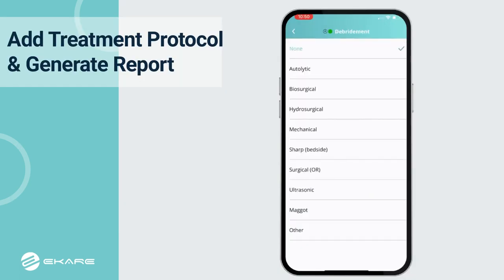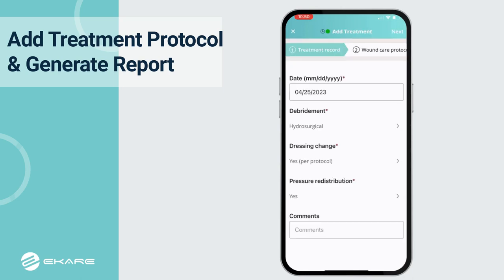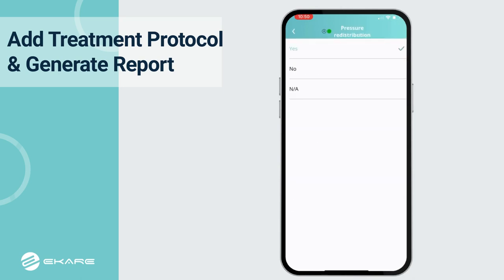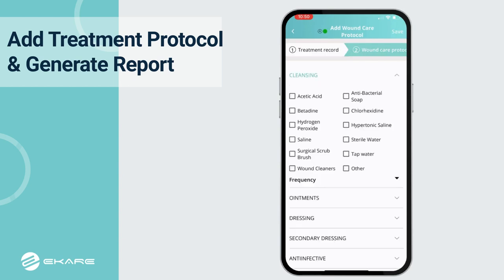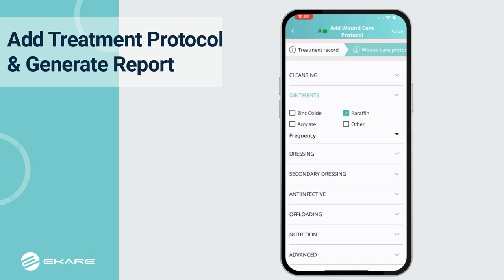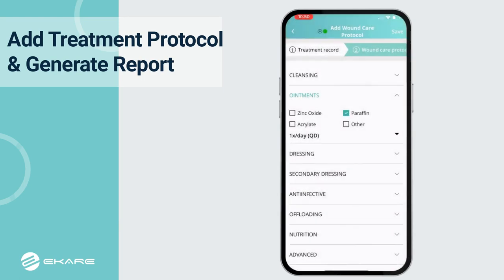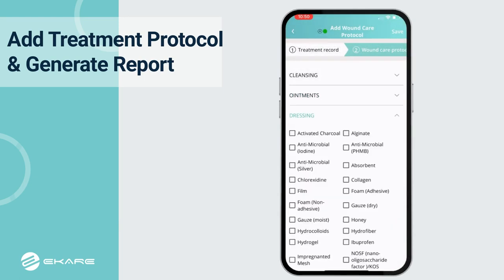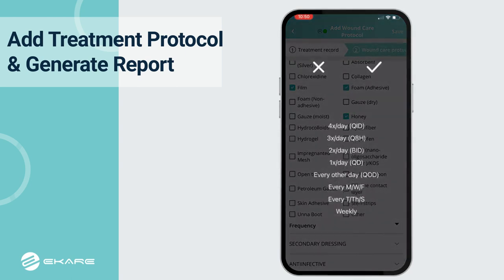Document details on debridement, dressing changes, and pressure redistribution. Users can document protocols covering cleansing of the wound, ointments, and customized dressings, which can reflect the specific products and protocols at each facility or location at your organization. Frequency of use can also be customized based on your needs.